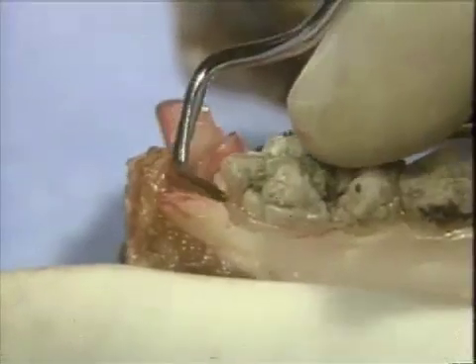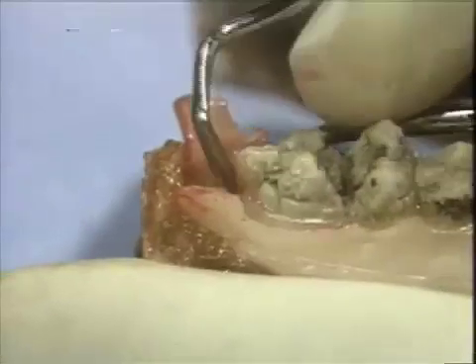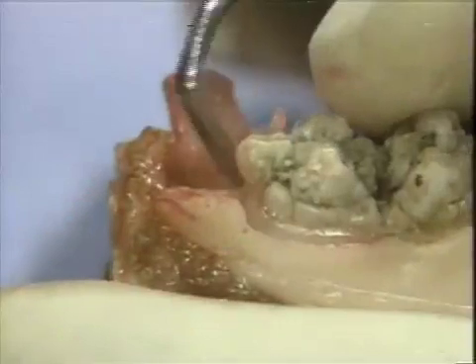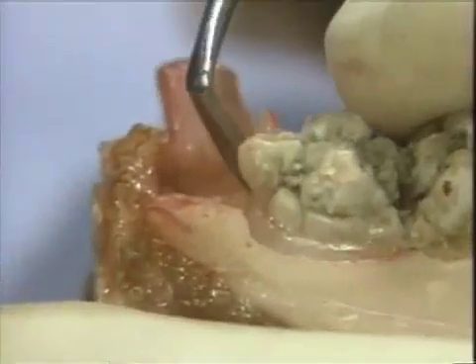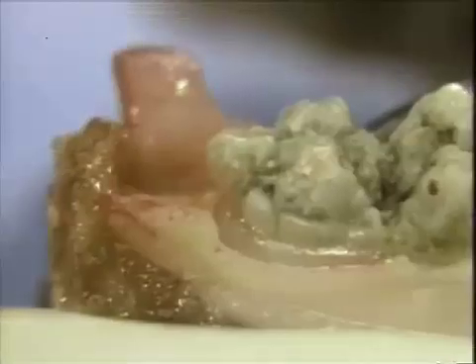Once this tissue is removed, the distal surface of the molar tooth can be thoroughly instrumented, and any osseous correction accomplished.